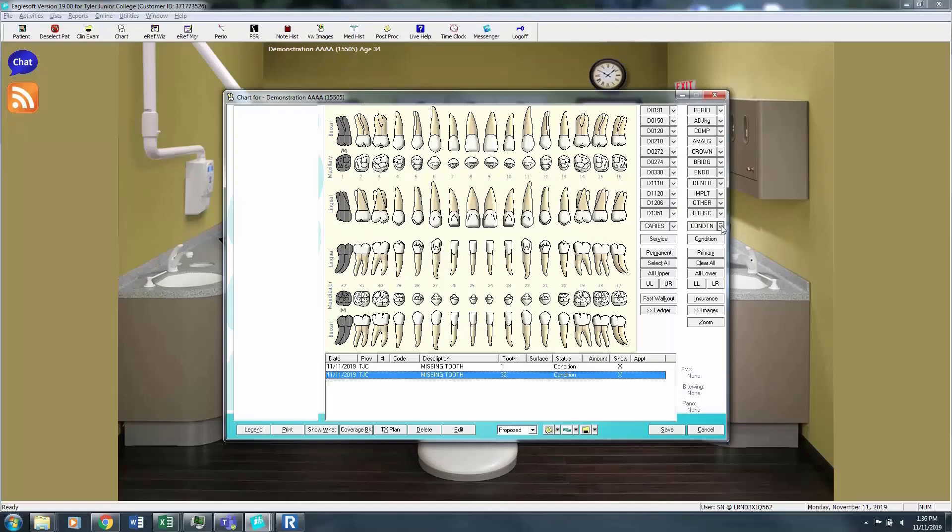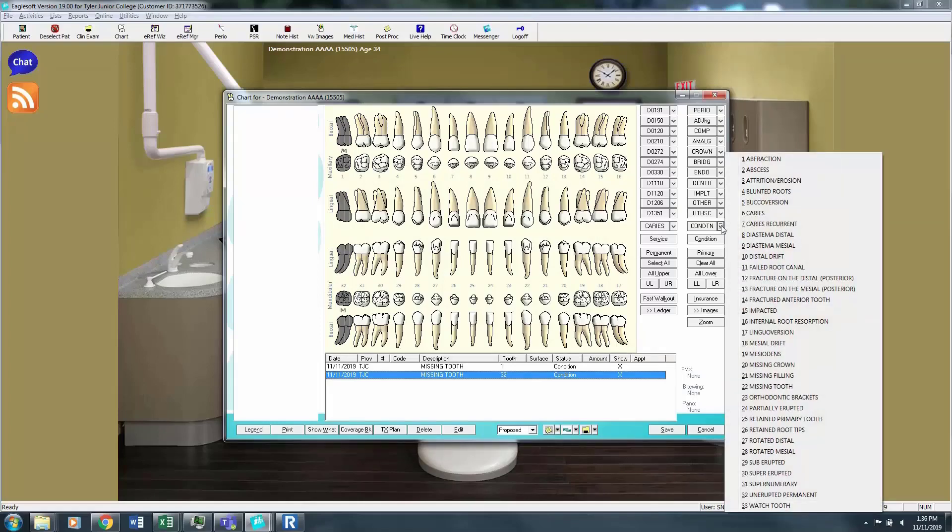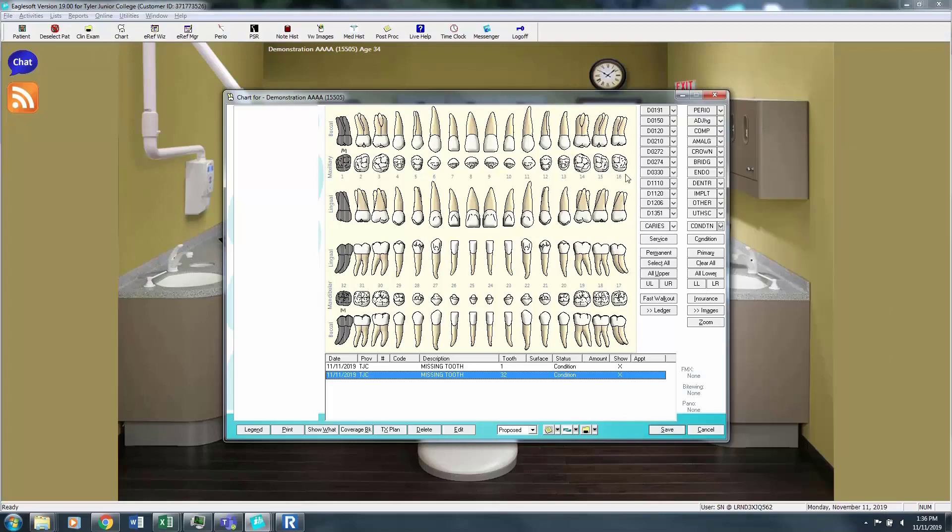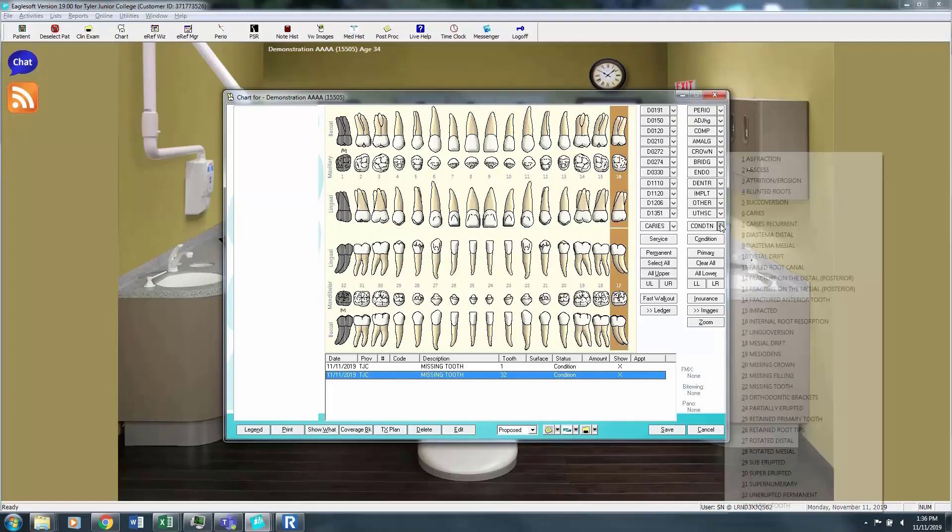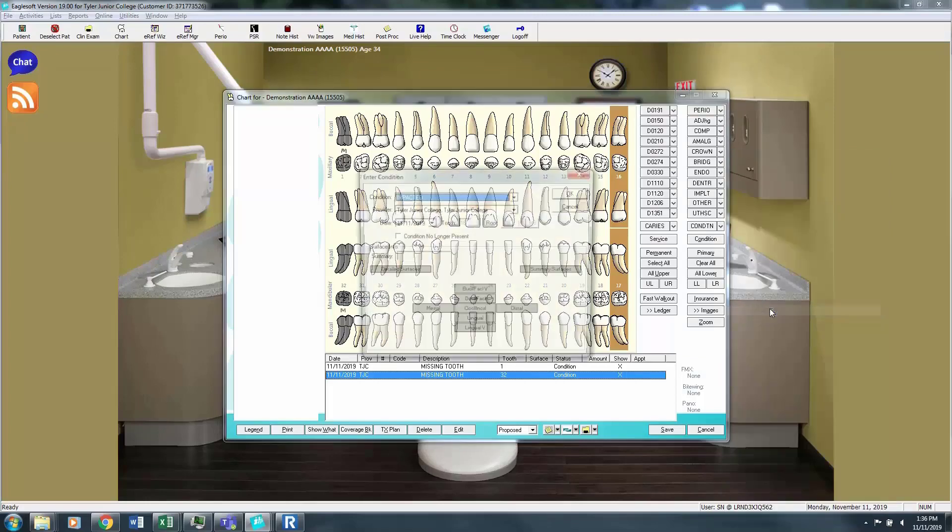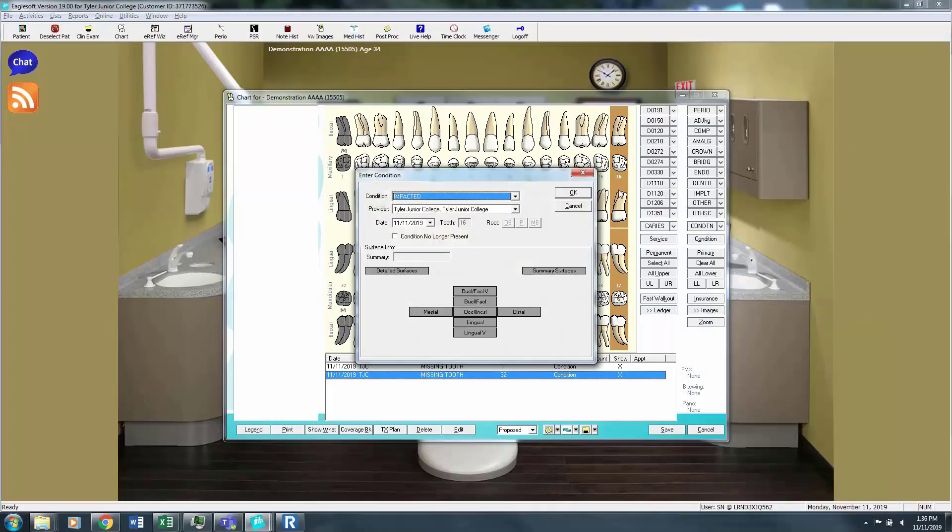You'll notice I clicked on the conditions tab. If you're unable to find what you're looking for in the other tabs, then the conditions tab has a list of 33 different conditions that could be used for any given tooth. I'm going to click on 16 and 17 and say that this patient has these two wisdom teeth impacted.